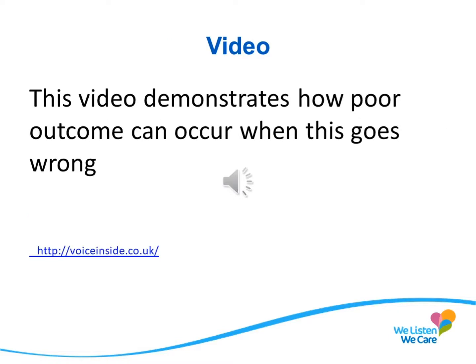Many of you will have already seen the Time Escalation Decision series of videos produced by the University Hospitals of Leicester team. If you haven't seen this, please take a moment to copy the link into the browser and take the time to watch this video. It really outlines the importance of not only how we view a CTG ourselves, but how we communicate it with our colleagues and with the women in our care, and how that can impact on the overall outcome.